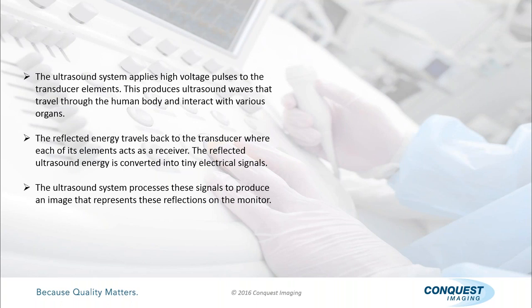And the reason I wanted to bring this up right now is we just talked about contrast resolution, and if you were to try to measure contrast resolution from the top of the phantom with the most dense material on top, what's going to happen is you're going to give up all your acoustic energy while trying to penetrate that one highly dense object, and you're going to end up with a huge shadow below it, and your reflected energy is going to be lost on all the other objects below it. So it's important that you understand that as you're going through different density materials, you're not giving up all your energy right up front.